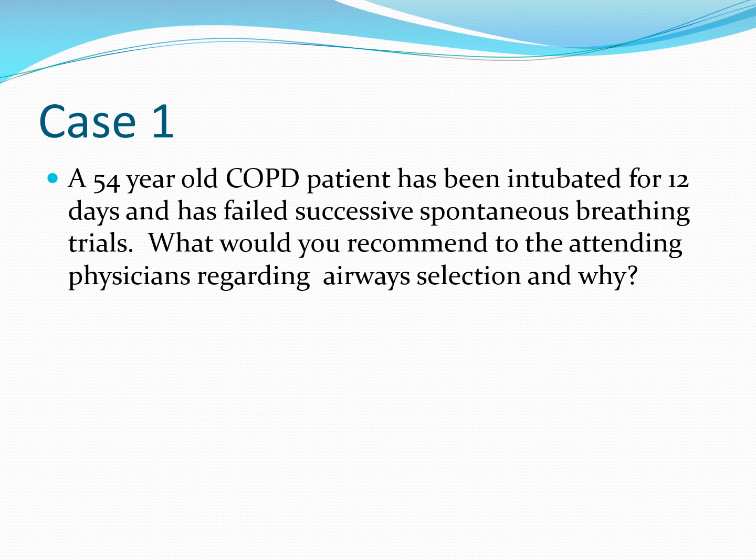The second big reason is, as I alluded to very early in this presentation, the trach tube is about a third the length of an endotracheal tube. So patients will tend to wean much better with a trach tube in place than with an endotracheal tube.